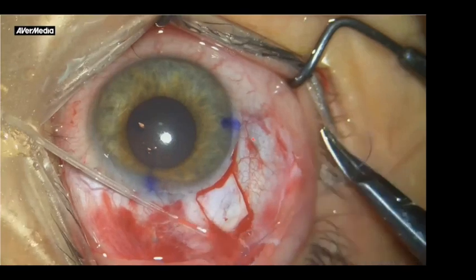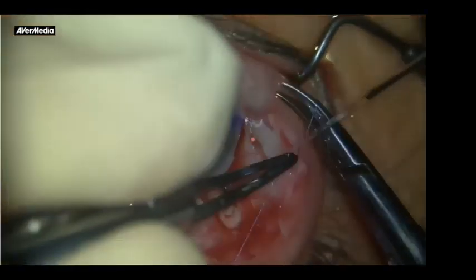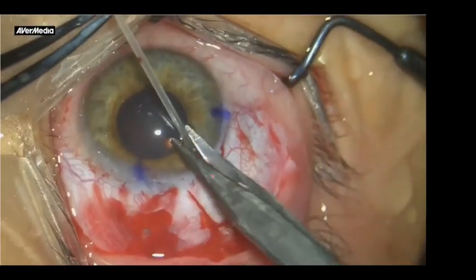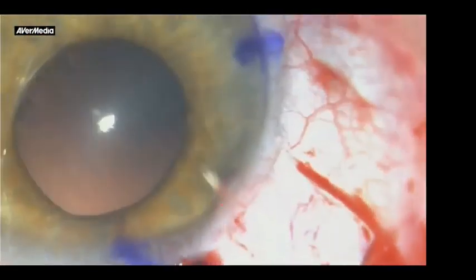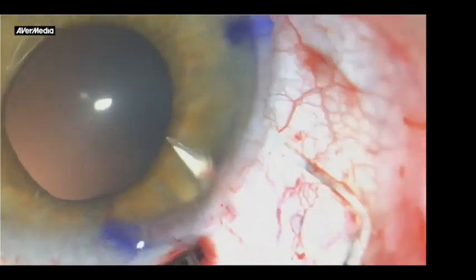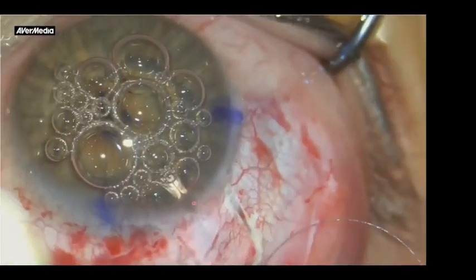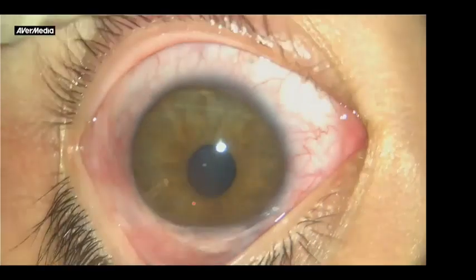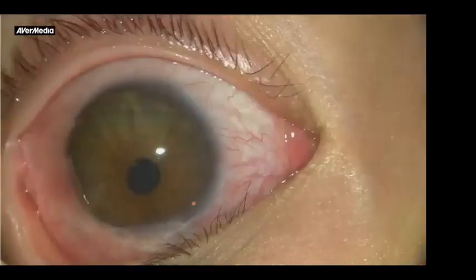So that I'm closing the tube, and some surgeons are doing a kind of perforation of the anterior part of the tube, a kind of venting, so as not to occlude everything, a kind of anterior venting of the tube. So the tube is occluded temporarily here, but I'm not using it. It's so bulky that I feel in my hands that the Ahmed valve is better.